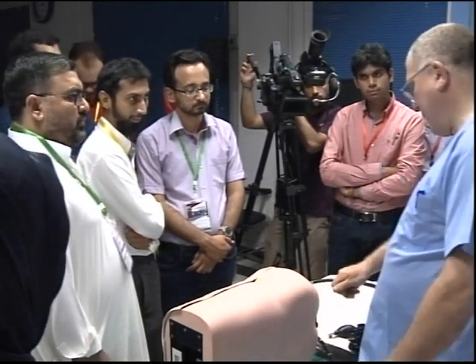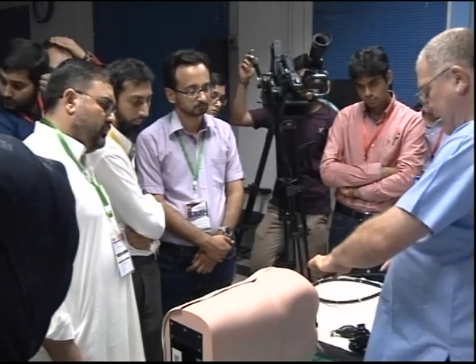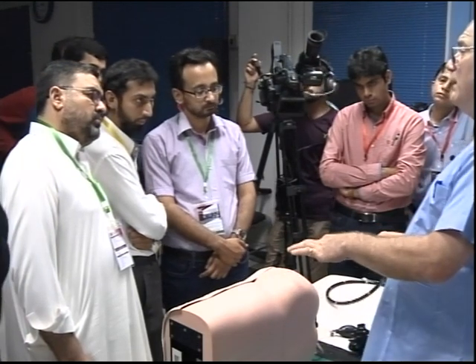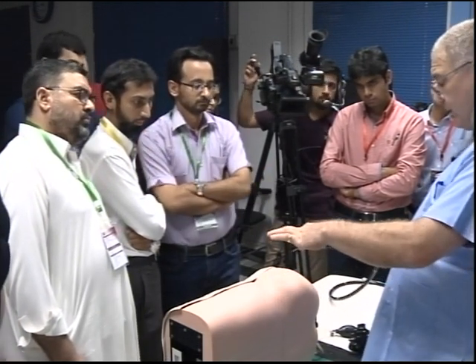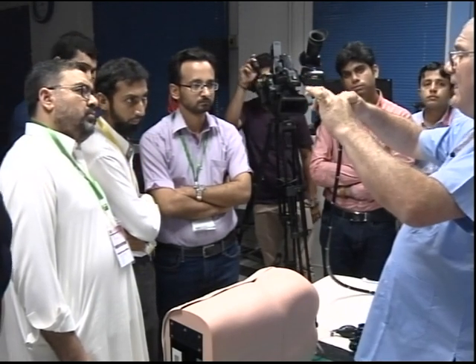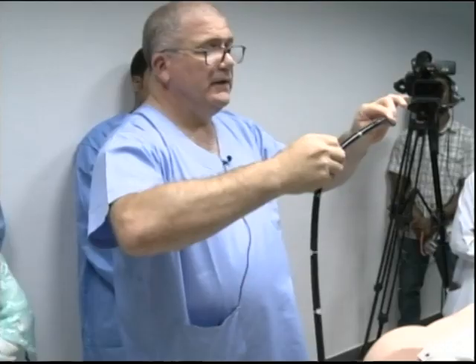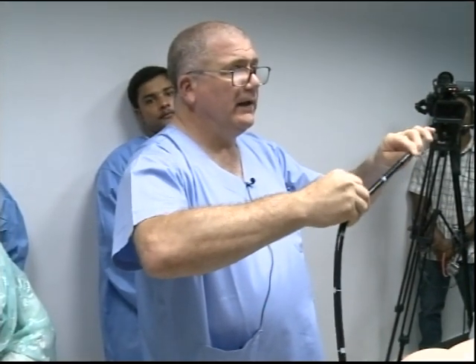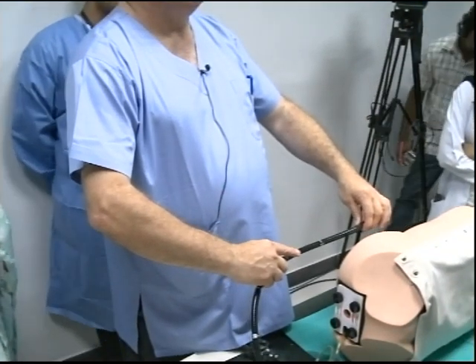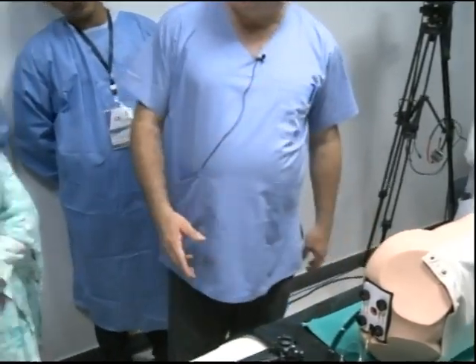Okay, so coming out, I have a sheet, make sure they're covered. So in particular in the ladies, make sure you've got a straight scope. So I don't hold the scope like I would do in the UK. I hold the scope here with the finger down the back. Reason why I put the finger down the back, it stops it. In the UK, I hold it like this because I can be here. Here, I put my finger here. So you need to adapt what you've got for the purposes you've got.